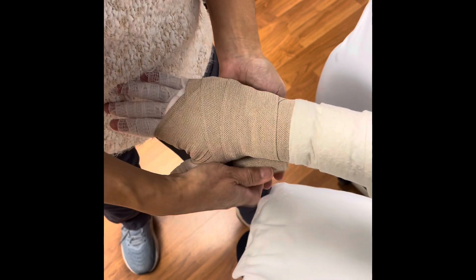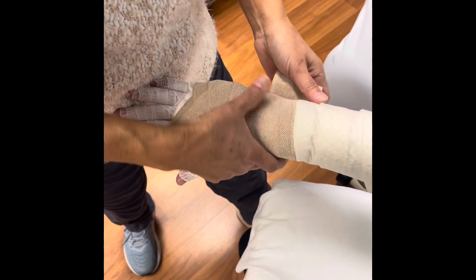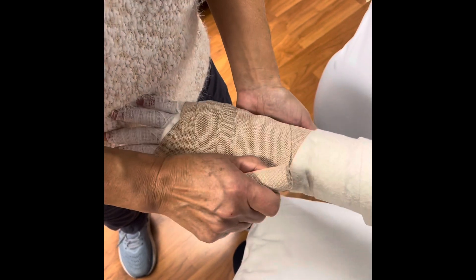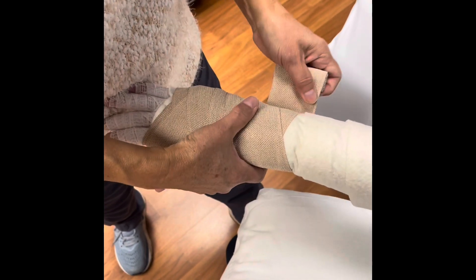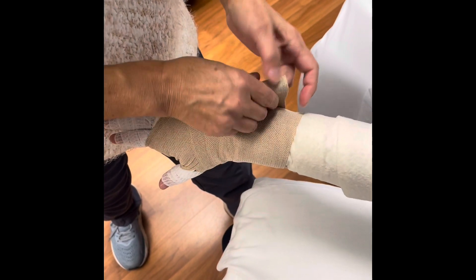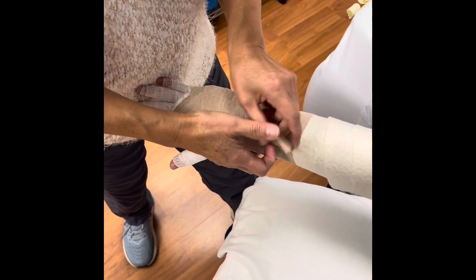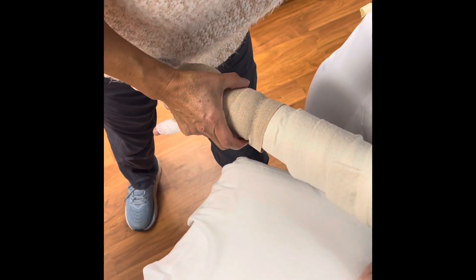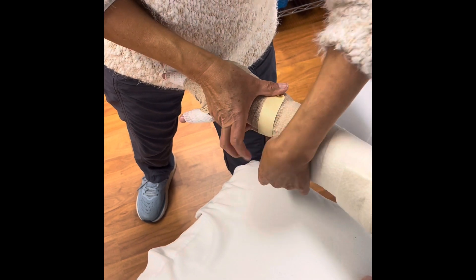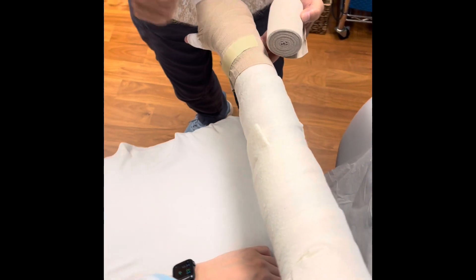From there we go on up to the wrist and forearm, using a spiker pattern all the way up the arm. You want to give a little bit of tension — pull the slack off the bandage as you pull it up, and as you pull it down, tape it so it doesn't go anywhere. Then we start with the next bandage.